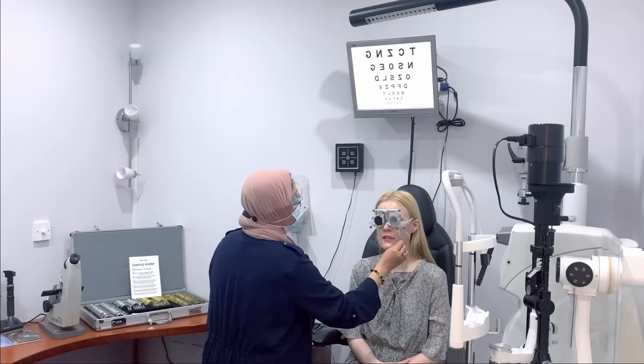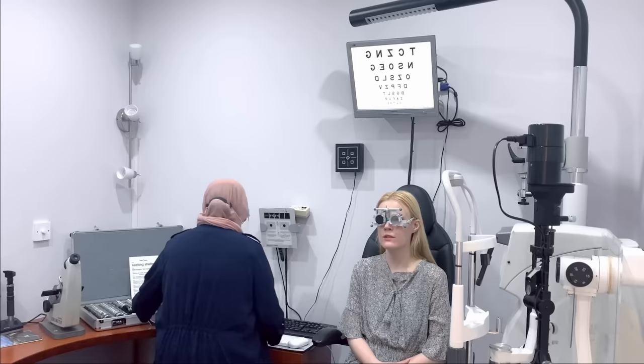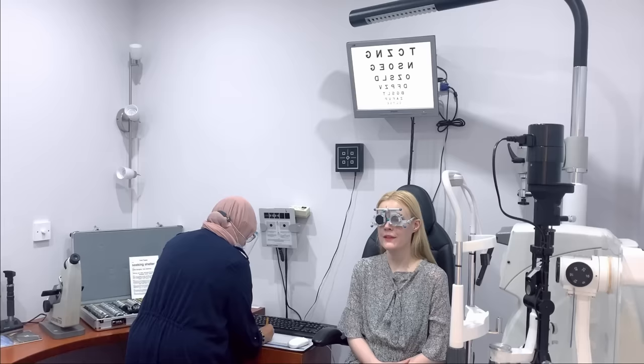And would you say that's better or worse? Or about the same? Worse? Yeah, worse. Better without it, yeah? Yeah, much better without. Okay, so there looks like there possibly is a little bit of a change to your prescription as well. Oh, wow. Not a huge change.